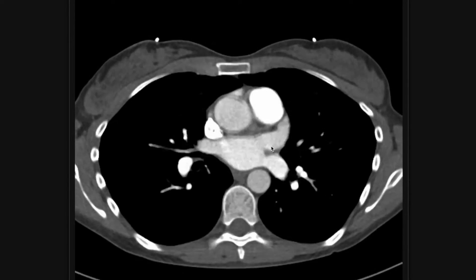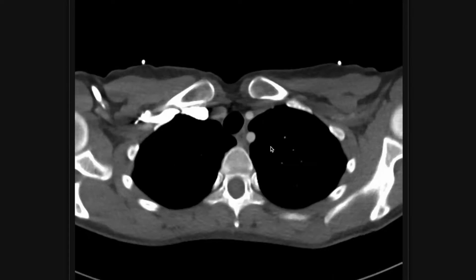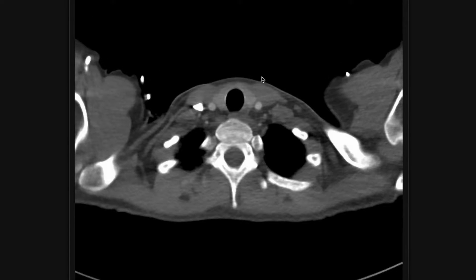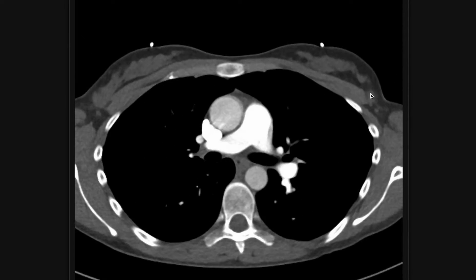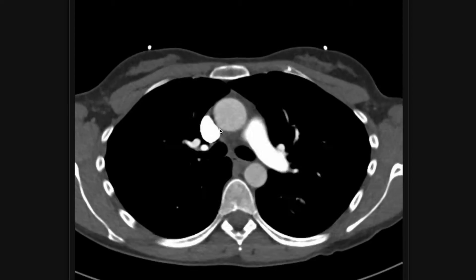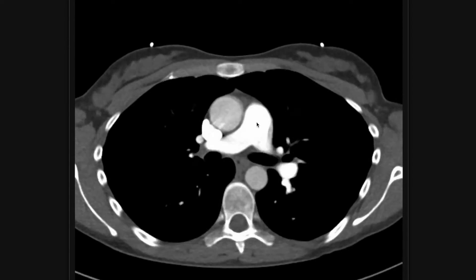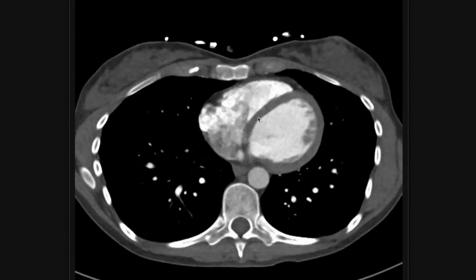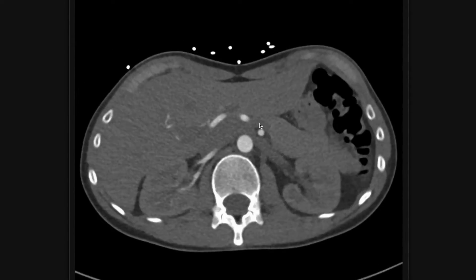After looking at all the cardiovascular structures, I go back to my normal search pattern for a CT chest. I take a look at the neck and thyroid, then look for lymph nodes in your axillary regions, hilar regions, and mediastinal lymph nodes that are by the trachea and aortic arch.